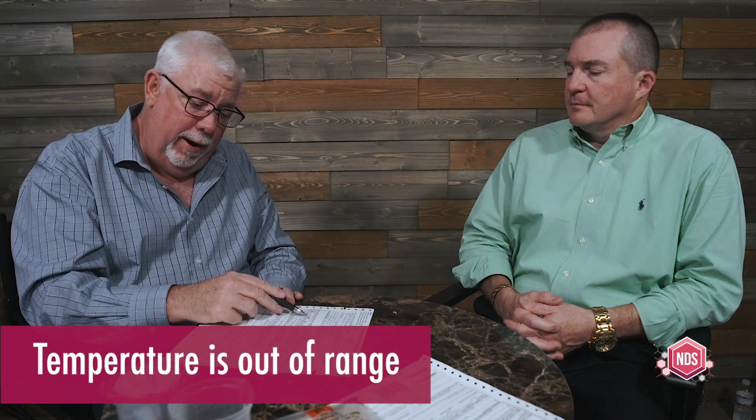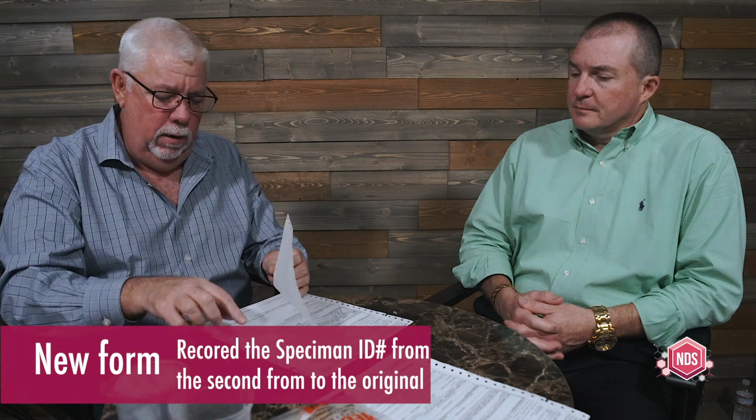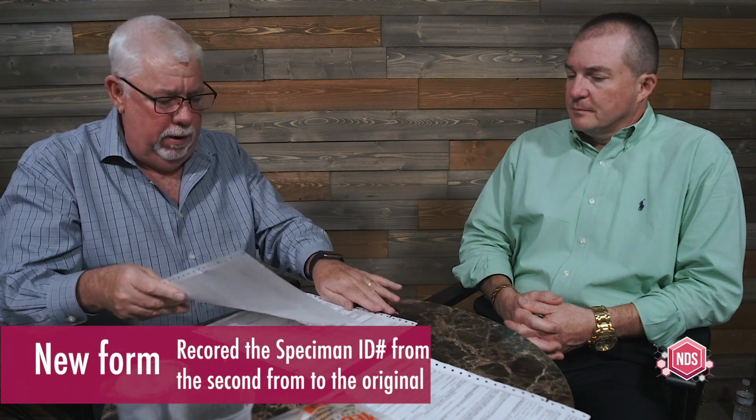And I'm just going to go back and double check that I filled out everything properly. And I do have the proper notes, temperature out of range, specimen 1 of 2. And I've recorded the specimen ID number from the next form I'm going to be using. Top copy is the lab copy. It's going to go in the bag to the laboratory with the barcode facing out so the lab can scan it.